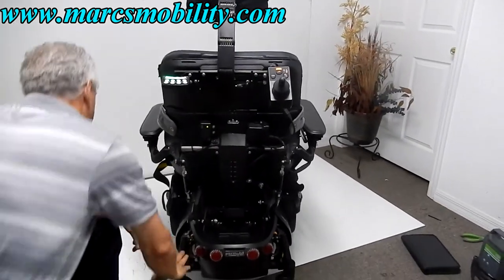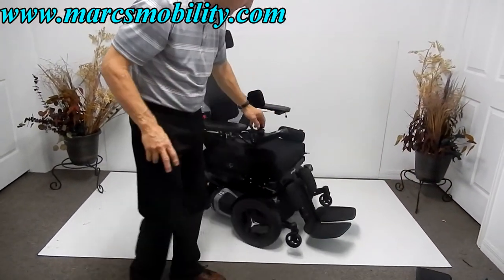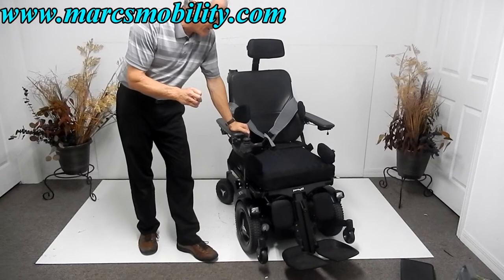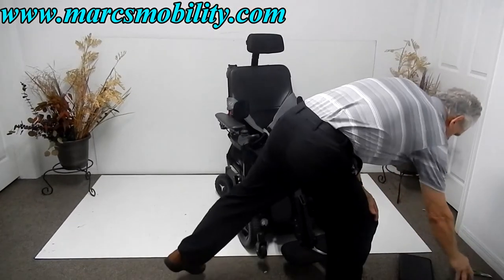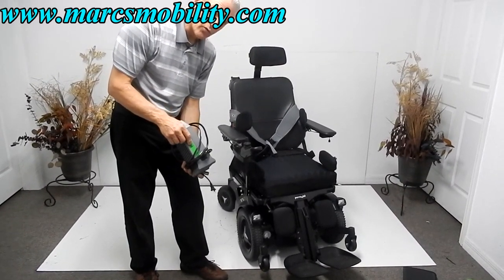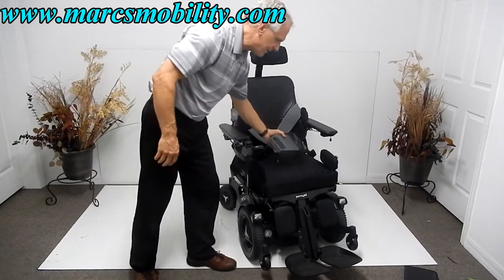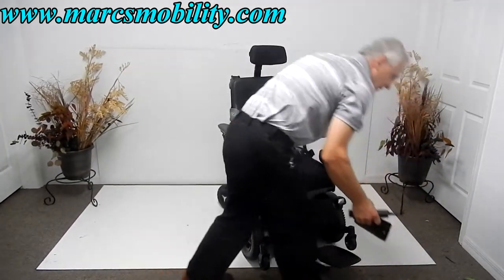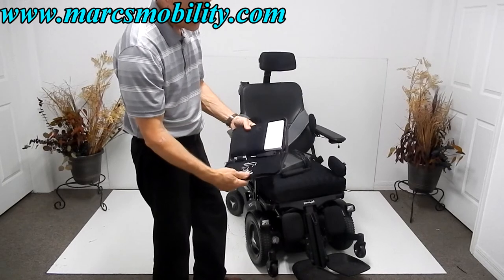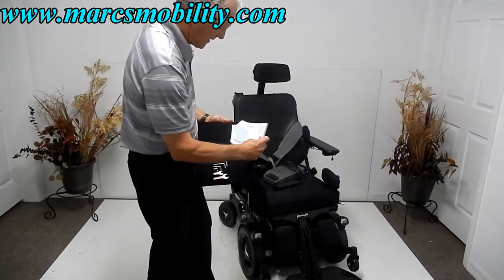This chair has everything. It takes two Group 24 deep-cycle 75-amp batteries. To charge, just plug the charger into the bottom of the joystick. When the charger light turns green, it's fully charged — the charger shuts off automatically. This chair comes complete with the knee brace, pump, tool kit, and owner's manual. Everything from the factory is included and the chair is ready to go.